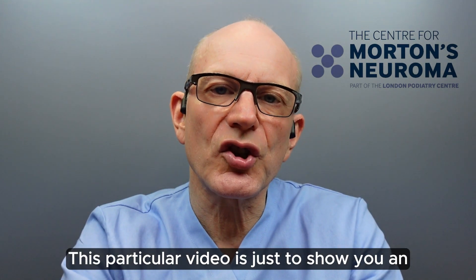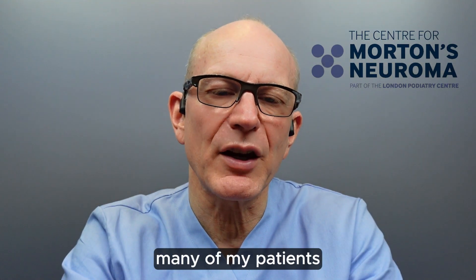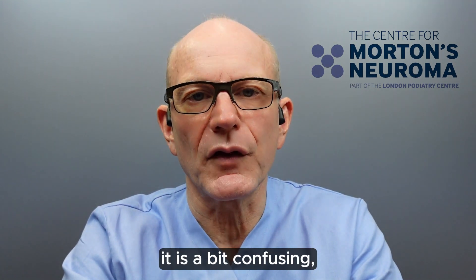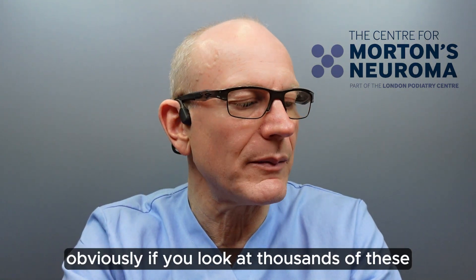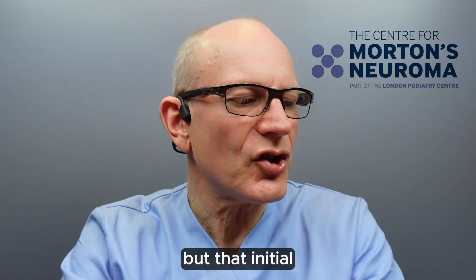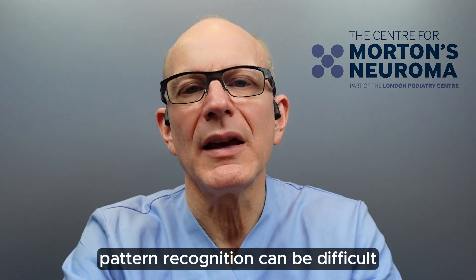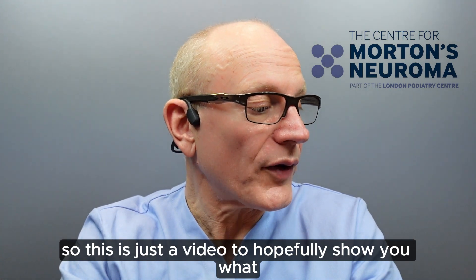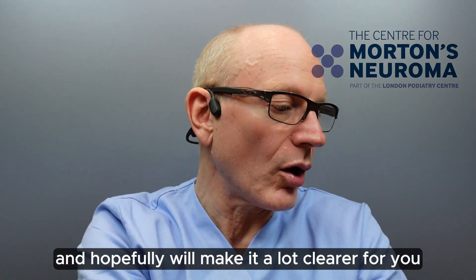But this particular video is just to show you an ultrasound scan of a neuroma. Many of my patients, when I try to explain it, are a bit bewildered — it is a bit confusing. Obviously, if you look at thousands of these, it becomes very easy. But that initial pattern recognition can be difficult. So this is just a video to hopefully show you what I look at and make it a lot clearer for you.